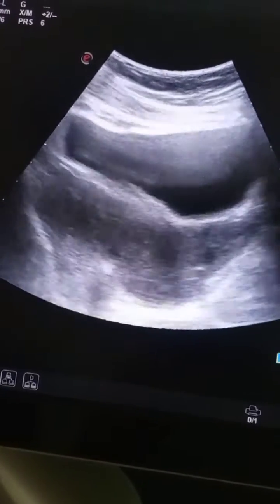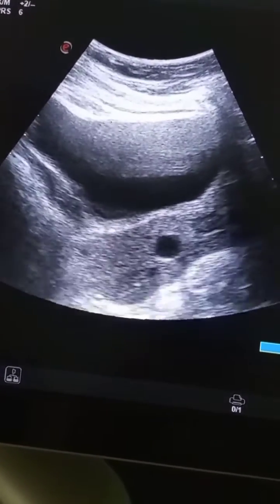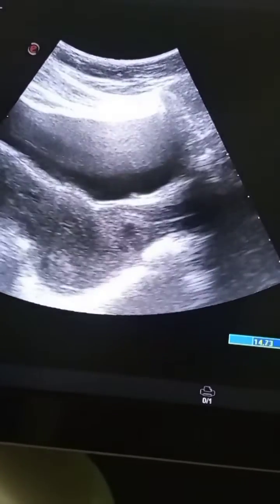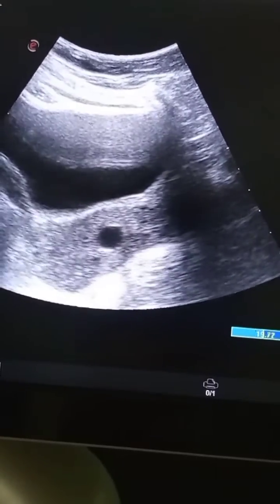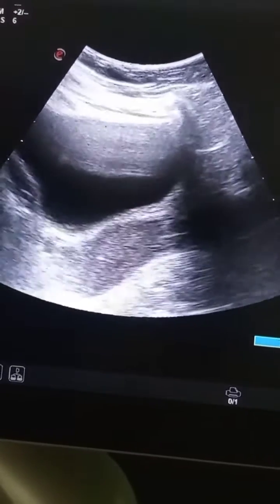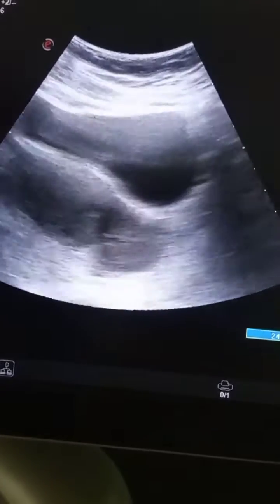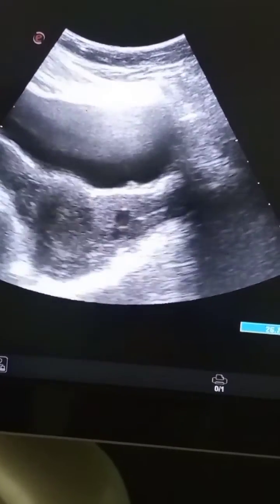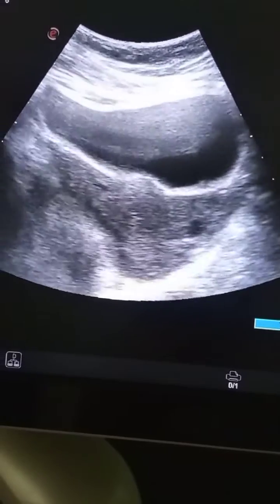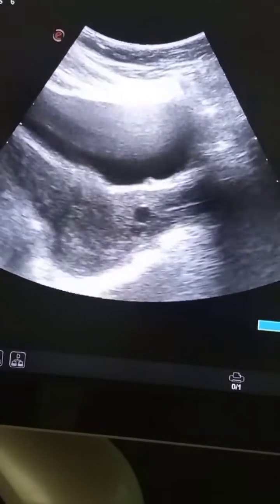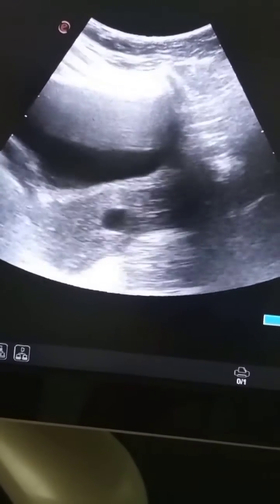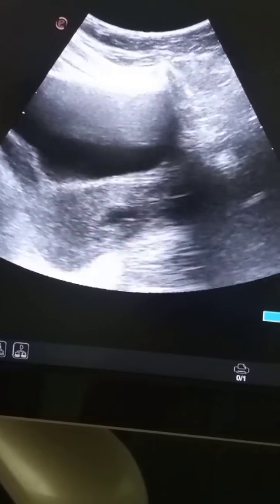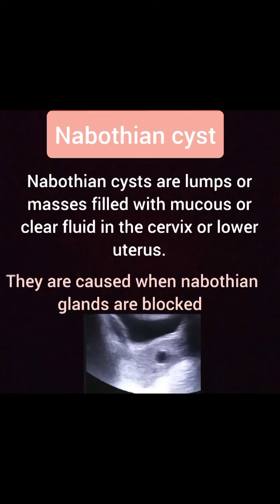There are clearly defined cystic areas in the lower uterus or in the cervical area, giving impression of Nabothian cyst. Here we are again viewing the uterus in transverse and longitudinal axis. In the longitudinal axis you can see two anechoic cystic areas in the lower uterus or cervical canal. These cysts have posterior wall enhancement, as I said earlier.